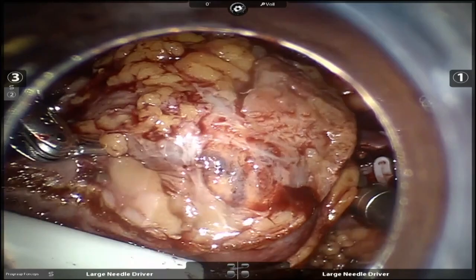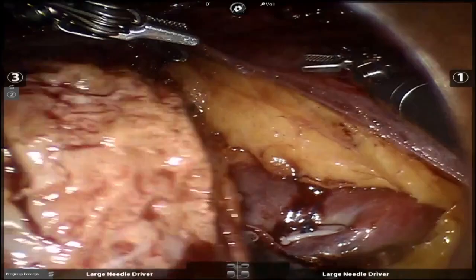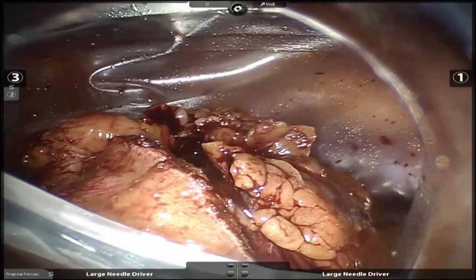Got good sinus. Hold on, Brando. Hold on. Let me elevate. Go ahead. Uh-huh. And let's do this over here. There you go. Perfect. Indy, you like the margin? You okay with the margin? Okay, good. All right. We're pleased with the margin as well.